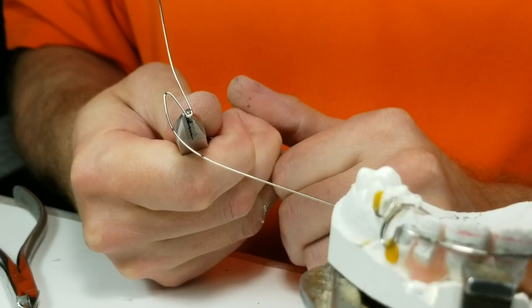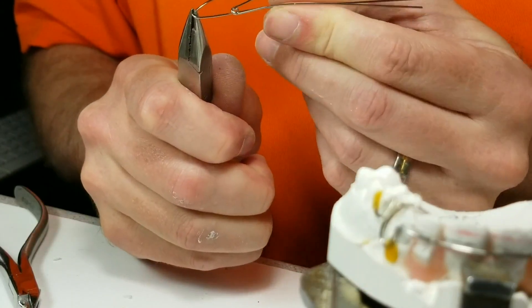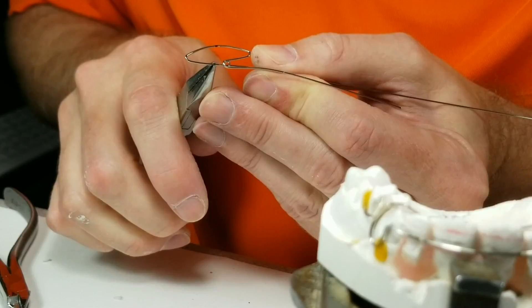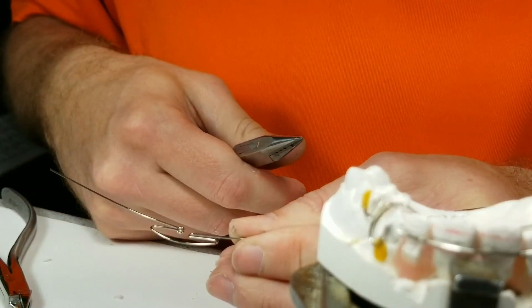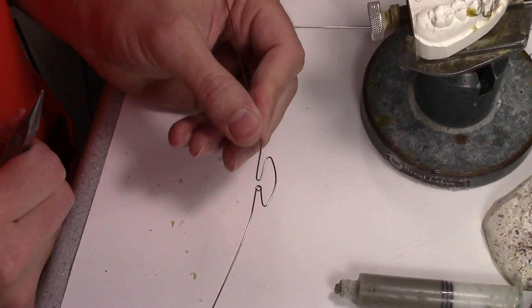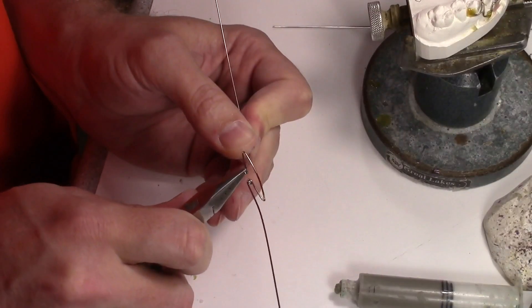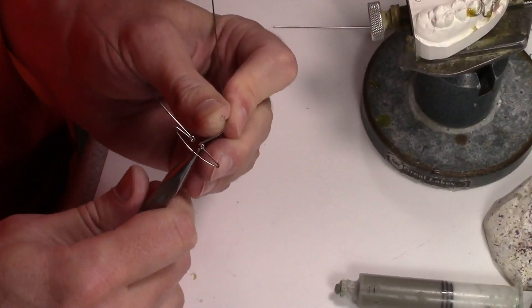I usually like to make these parallel with each other. On the next side, I try to keep these parallel as well. I'm going to grab here and go straight down. I'll look and see if it is even or not — it looks pretty even, so I'm going to keep going. I grip it, bend, loosen my grip, slide around, bend the wire — loosen my grip, slide around, bend the wire — and just keep doing that.